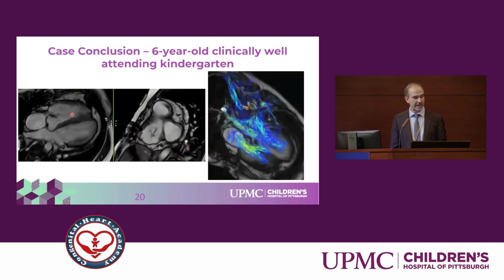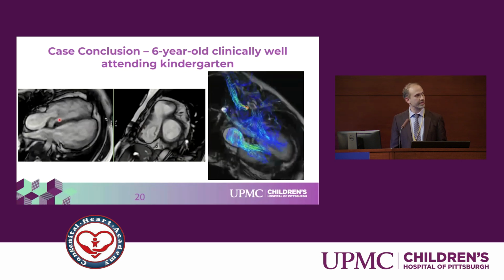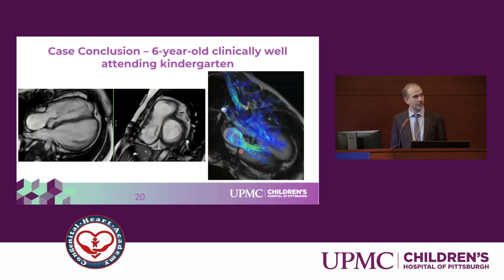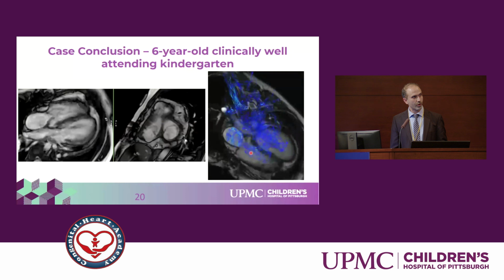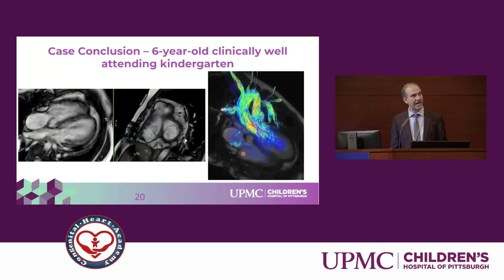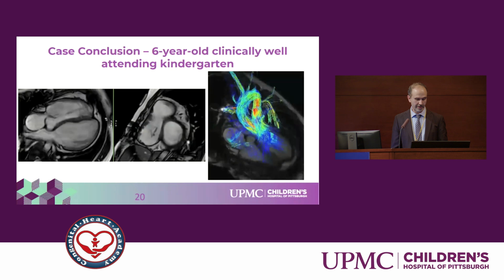You see here the cone or the reconstructed tricuspid valve. You see the tricuspid valve en face as well, and you see that there is good antegrade flow across that tricuspid valve with only trivial regurgitation here, and good antegrade flow across the pulmonary valve.